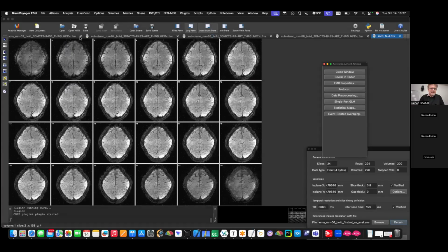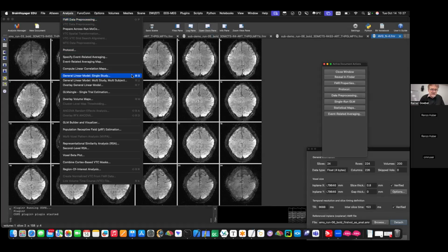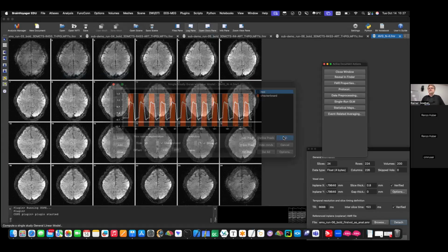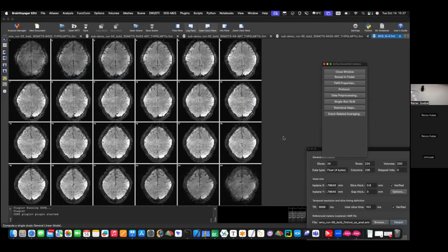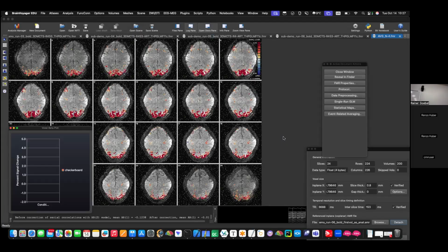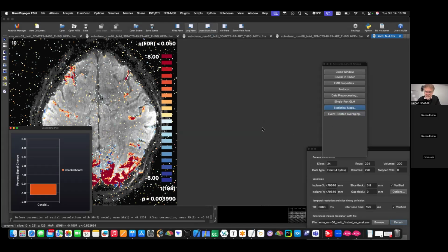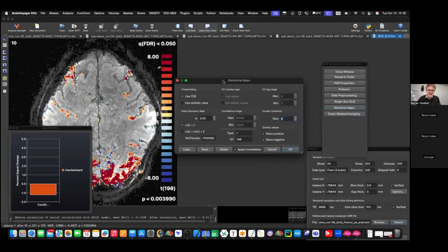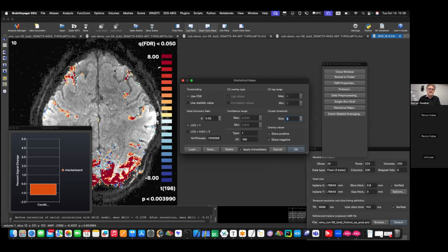And then if you run the statistics, general linear model single study, on this one, which is now the average of 4 times 12 trials, your computer explodes because you get such strong statistics, right? This is just insane, right? Look, this frontal activity, Federico, the frontal eye field. Look, and with the 4 runs, you have more areas coming up. It's extremely strong.